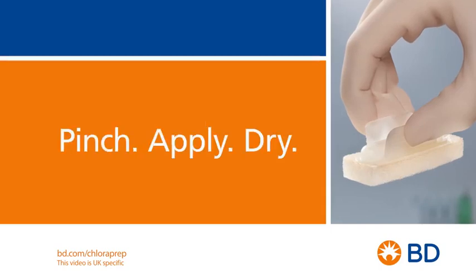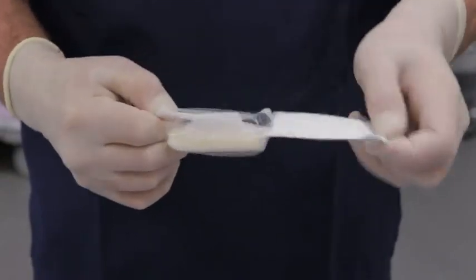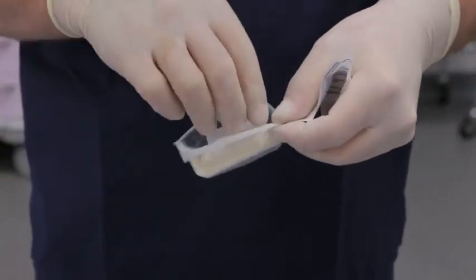Simply pinch, apply and dry. To get started, remove the FREP applicator from its packaging using an appropriate aseptic technique.